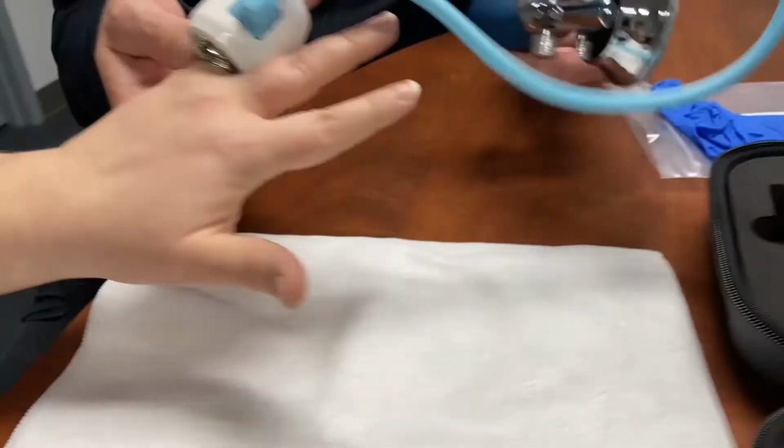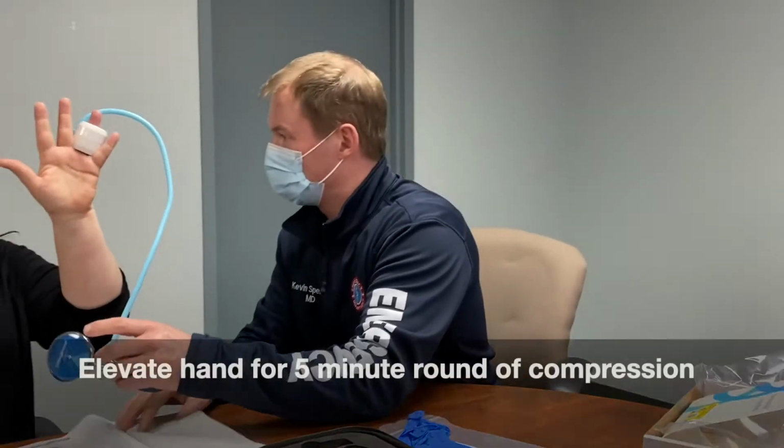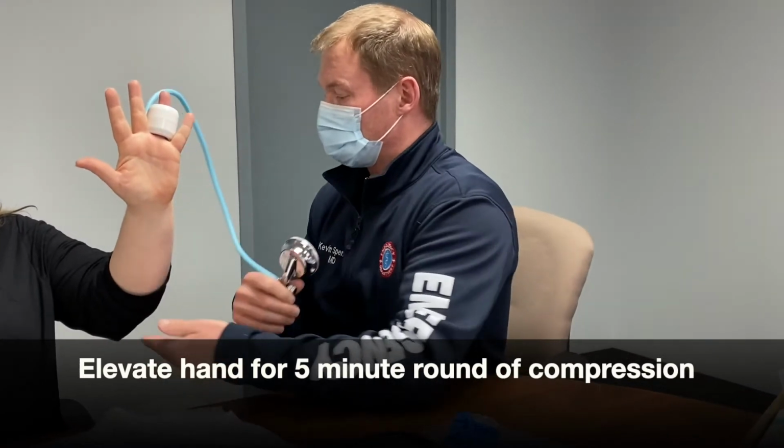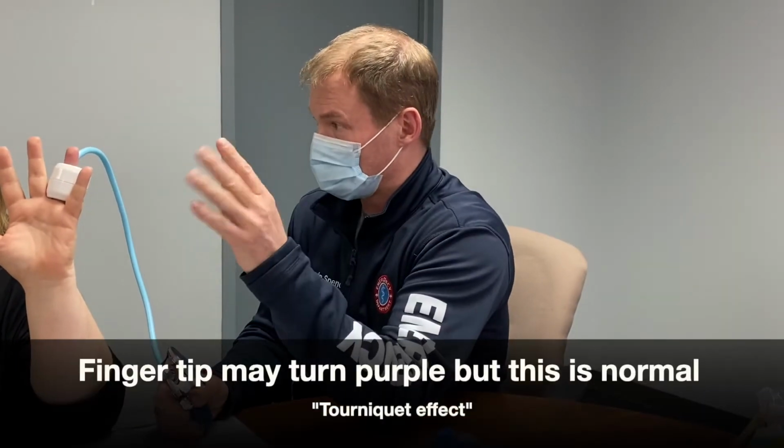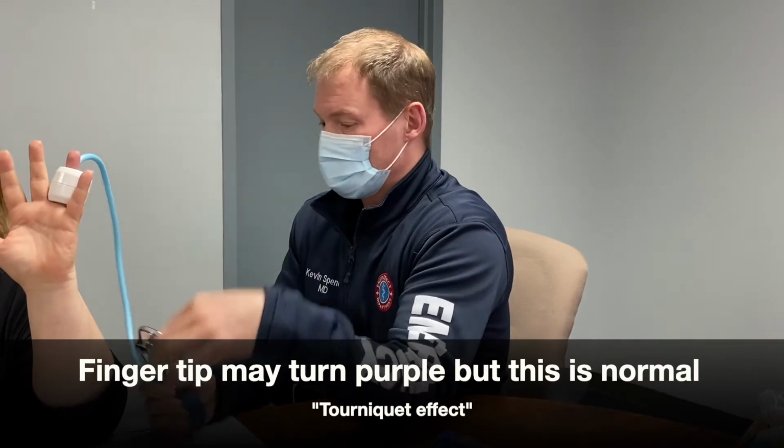So we're going to get you to raise your hand up for 5 minutes. It's not pinching you or anything like that? No. Yeah, good. So it should be totally comfortable. You can just rest your elbow on the table if you like. I always like to tell people, just because there's compression there, you'll see that the fingertip often turns a little bit discolored, a little bit of purple. Shouldn't hurt at all. As soon as you take the device off, the color goes back to normal, okay?